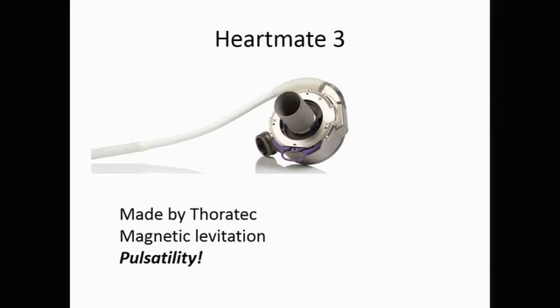The HeartMate 3 is also in clinical trials. We're inserting them at my shop. This is a device that, structurally speaking, is very similar on the inside to the HeartWare that I've already shown you a photograph of. It's made by Thoratec. Once again, it's got magnetic levitation on both sides, which they're very excited about because they believe it's going to be associated with less thrombosis. And it's a device that is, in many respects, probably completely interchangeable with a HeartWare.